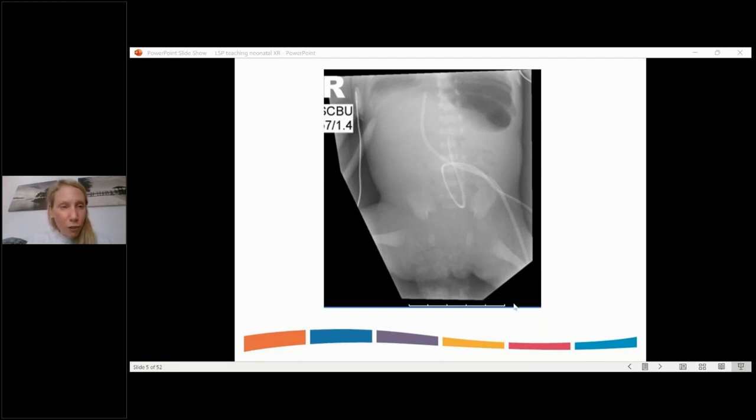I'm very impressed that you guys have noticed the chest signs straight away, because this was missed by the team. So this is the UVC, for those of you less familiar, and that's okay, it's just below the diaphragm. And this is the UAC, but it's short. So if this is T12, L1, L2, so it's L3, it's a low UAC that comes with its own risks. It's much higher risk of thrombosis. So most people would remove it unless you were desperate for it, because the optimal position is T6 to T9.